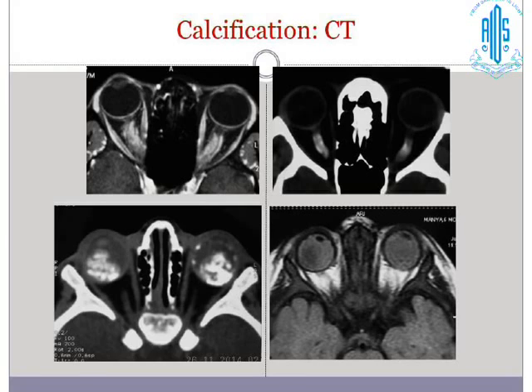Retinoblastoma, dense calcification on CT, are just not seen on MR. So understand the limitations of an MR also. While it is important to stage the pathology like retinoblastoma on an MR, you sometimes have to fall back on a CT to make a diagnosis.